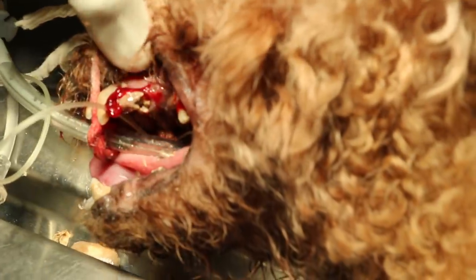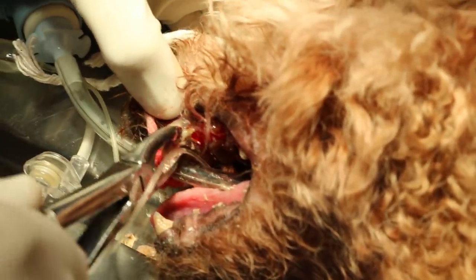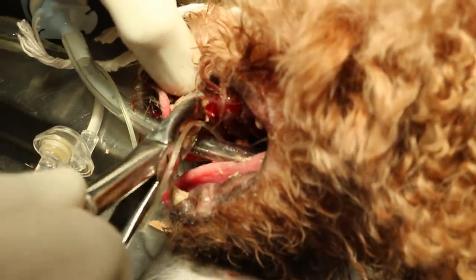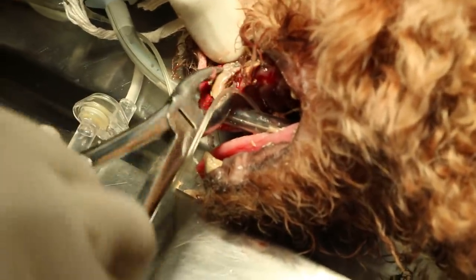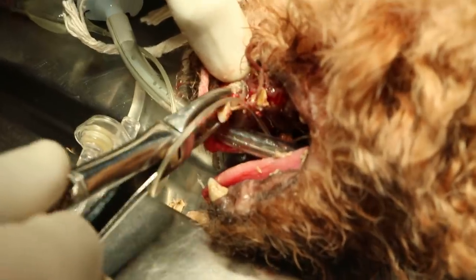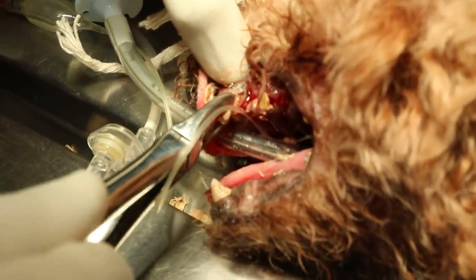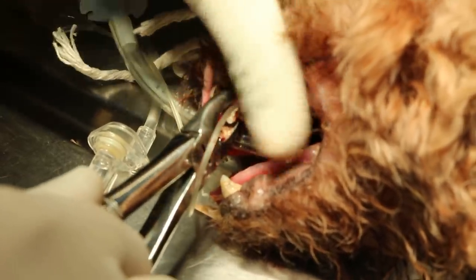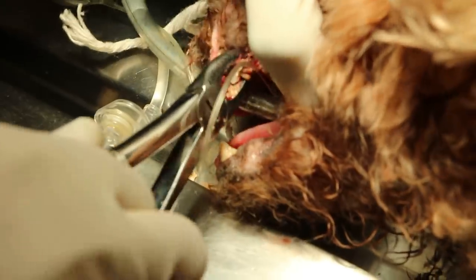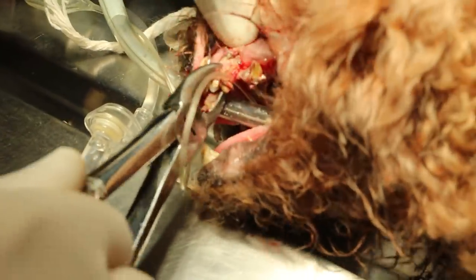The next one — premolar 3, premolar 2, premolar 1. Then the canine. The canine is also full of tartar and the roots are exposed, so it's periodontal disease stage 4 — or stage 3, depending on the ligaments. Is it loose?